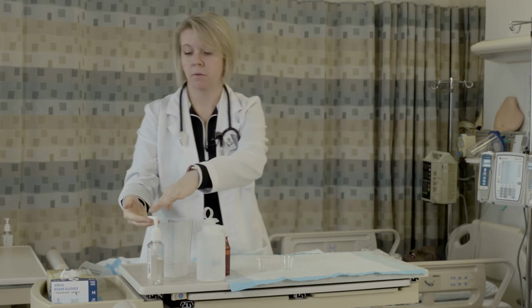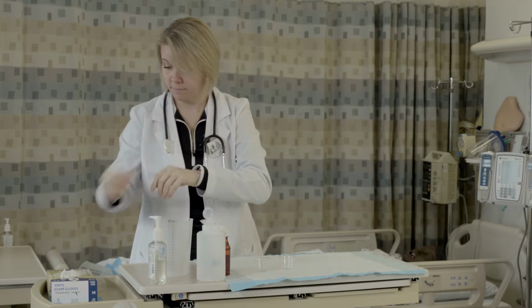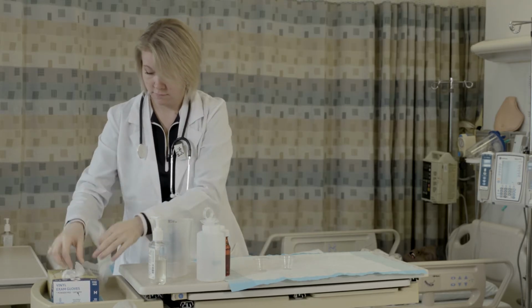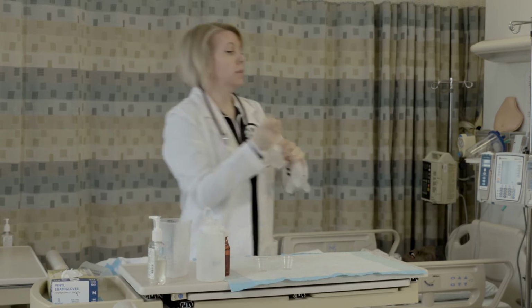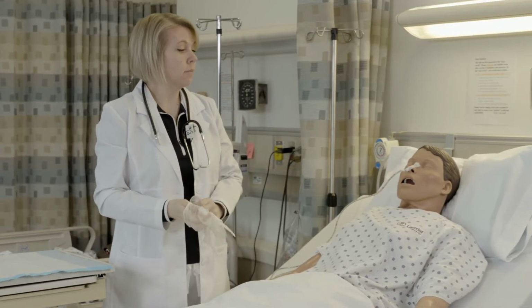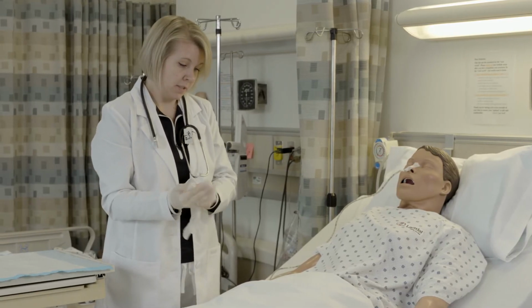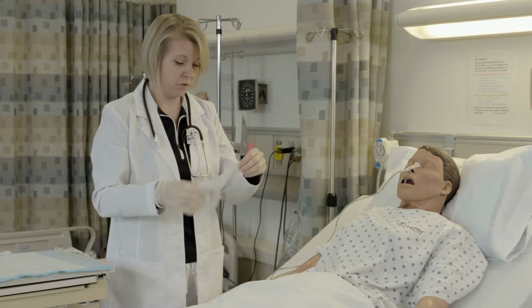The next thing I'm going to do is head over to the patient's room. I'm going to perform hand hygiene, and I'm going to put on gloves. Going into the patient's room, I'm going to introduce myself and ask the patient for his name, date of birth, and any allergies. He tells me his name and date of birth, and he doesn't have any allergies.